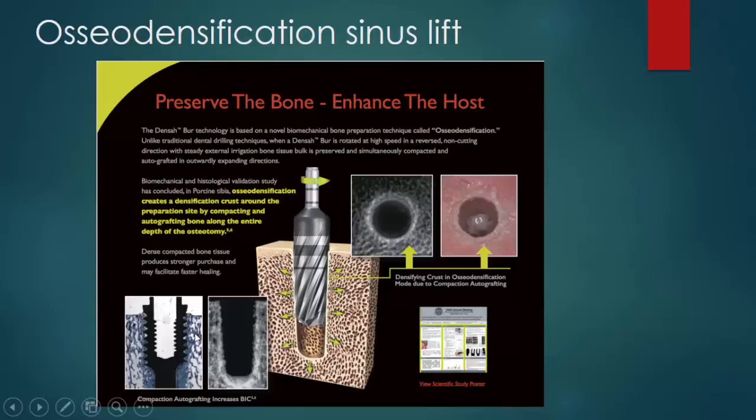فهي بهالعملية كمان لما يكون العظم طري بتحول لعظم قاسي، بصير في عندي insertion torque عالي للإمبلانت، وكمان ال contact between the bone and the implant is higher. يعني بتزود من ال contact مع ال implant.